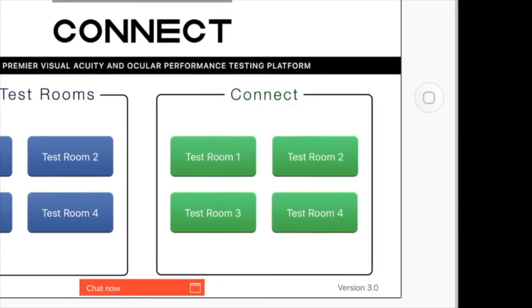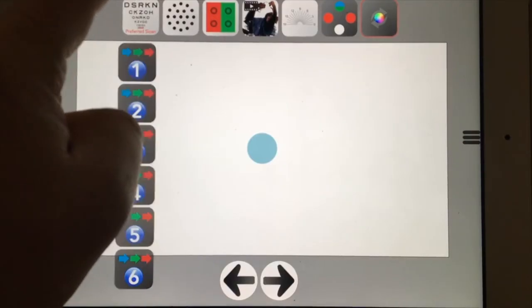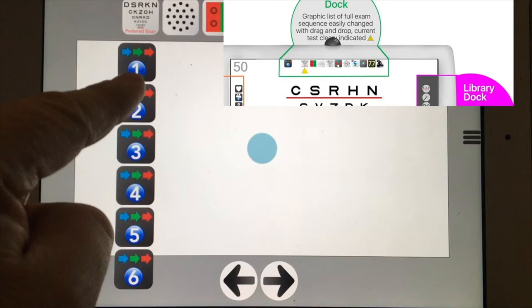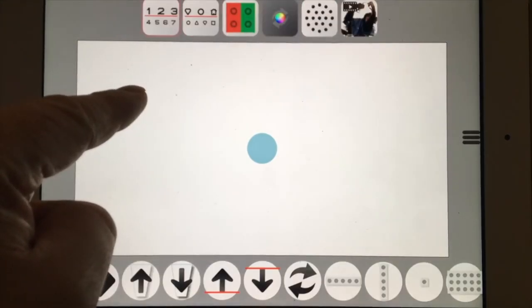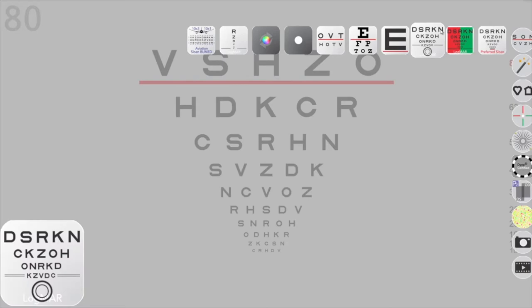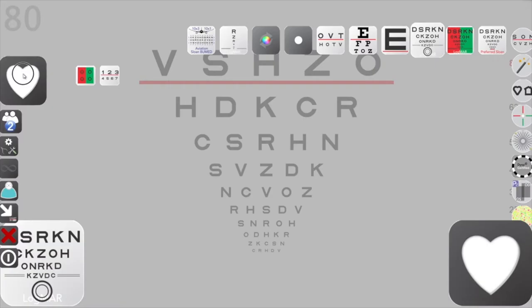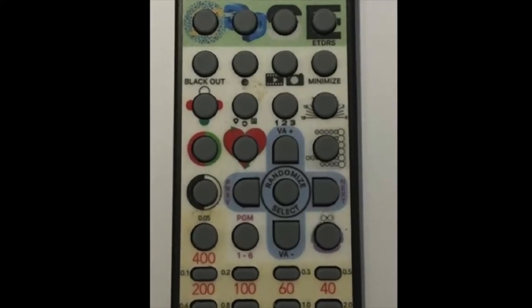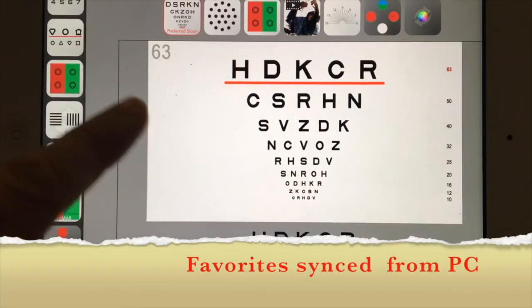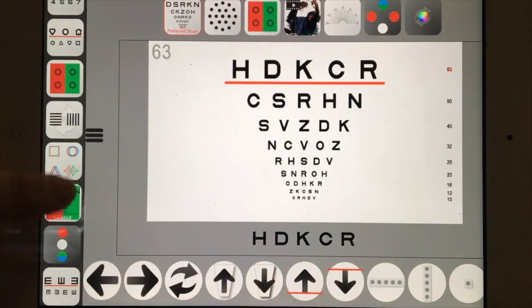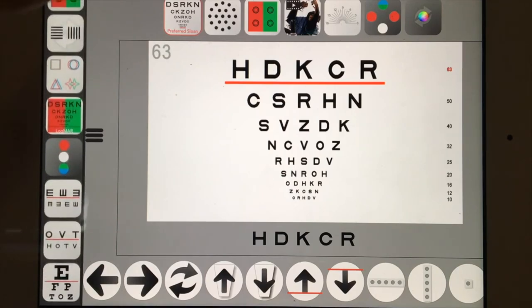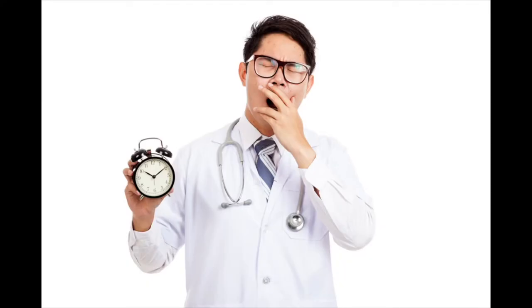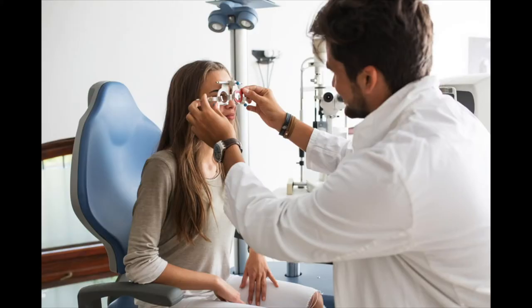For example, if you move to another exam room with a different sequences set up, the iPad will remain in sync with the current exam room. You can also add charts directly to your Favorites by dragging from the library on the right and dropping into the Favorites menu on the left-hand side. These Favorites can be cycled directly from one button on the remote control and will also appear in the iPad application for one-touch easy access. Sequencing will save you time and frustration, and your patients will appreciate that you value their time by testing them efficiently.